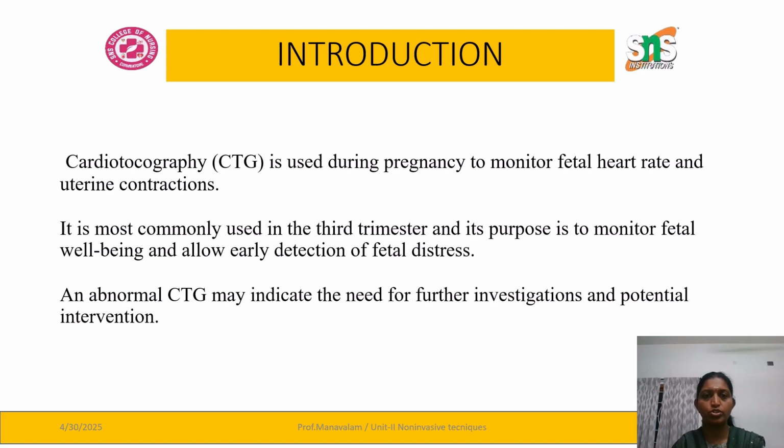The general introduction about the cardiotocography. It is a key tool that is used during pregnancy as well as during labor. In pregnancy, it is commonly used during the third trimester in order to monitor fetal well-being. At the same time, we can use this machine to detect fetal distress early, prevent complications and save the life of the fetus.